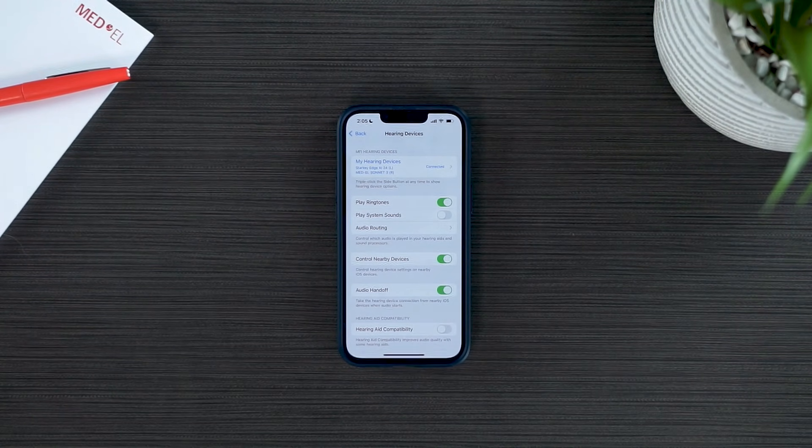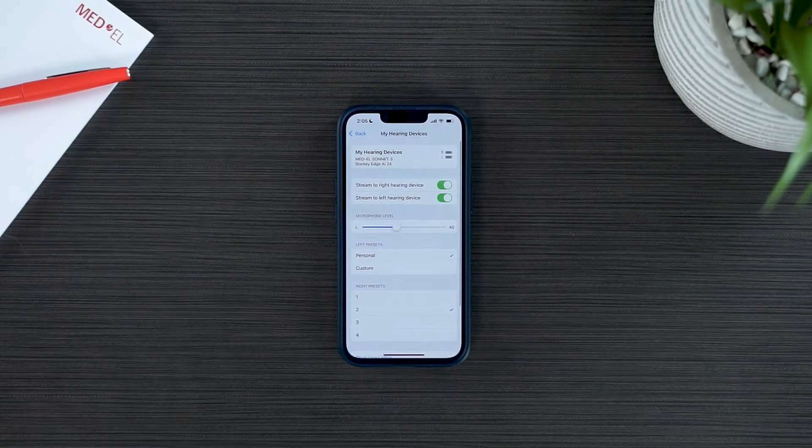At the top, your hearing devices should read Connected with both devices listed. If you do not see both devices, simply turn your Bluetooth off and back on to refresh the connection. You are now able to enjoy bimodal streaming with DualSync.